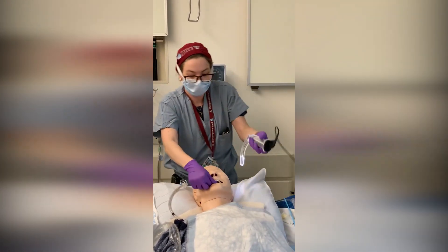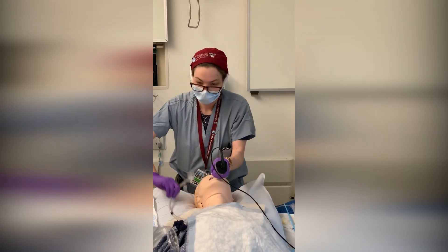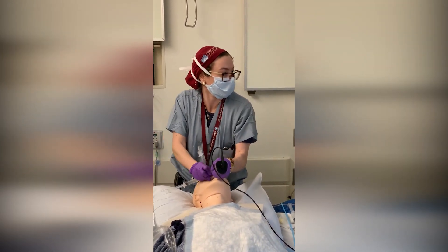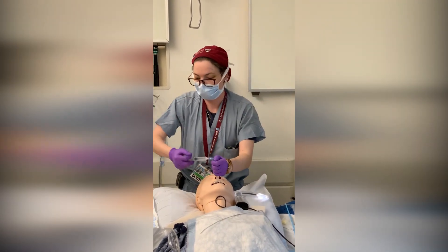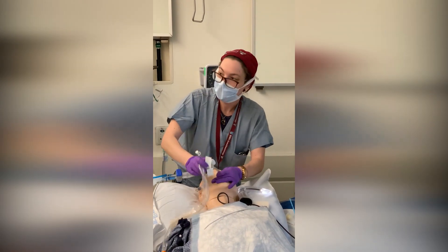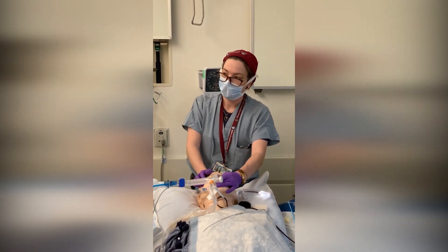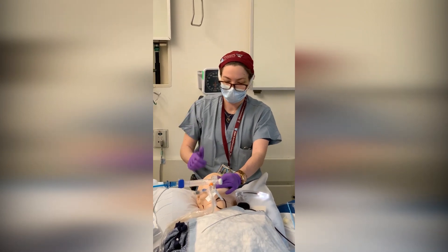Perform video laryngoscopy and pass the endotracheal tube to an appropriate depth, taking care to avoid mainstem intubation. Remove the blade and quickly remove the stylet, inflate the cuff, and connect the circuit. Turn the vent on. The respiratory therapist will turn on the ventilator and communicate when they see end-tidal CO2. [RT]: We have end-tidal CO2. [Physician]: Sounds good.